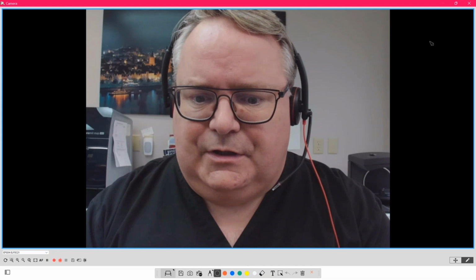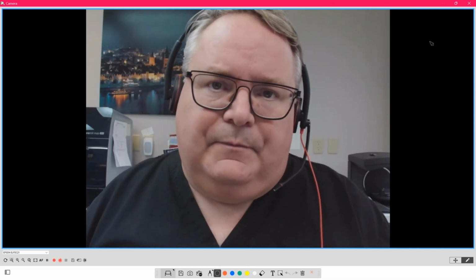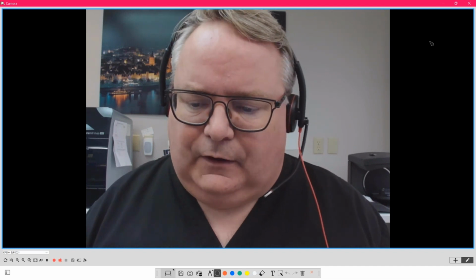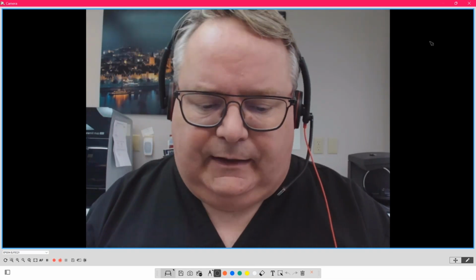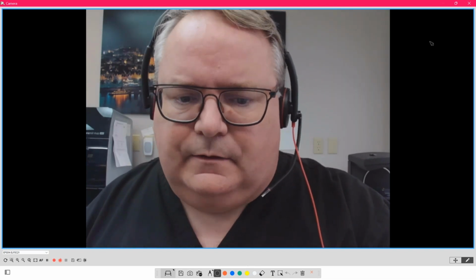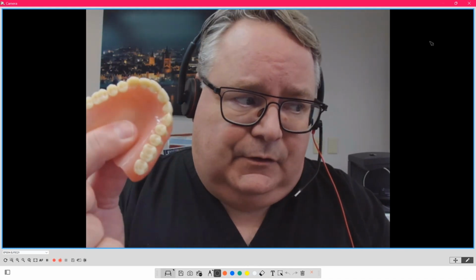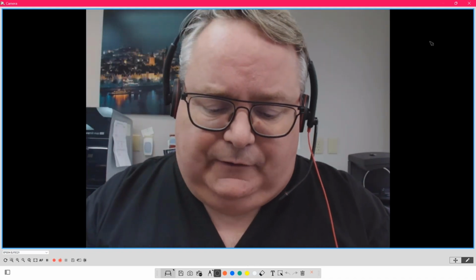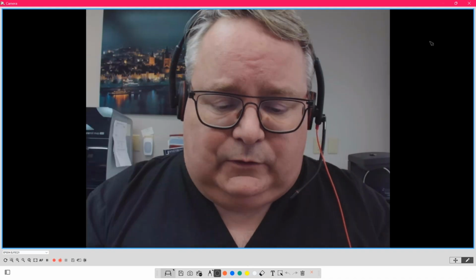A few things we wanted to do to get started was some of the questions that we use and have. Mark, what have you seen change when you changed your philosophy from, say, 20-degree teeth to a mortar and pestle tooth like VITA? Have you really seen the difference? What spawned my change of occlusion was, I used to build dentures using 20-degree teeth. This was our standard that I grew up with and was taught in school, and we built a 20-degree denture. This is, again, our gold standard of what we do.